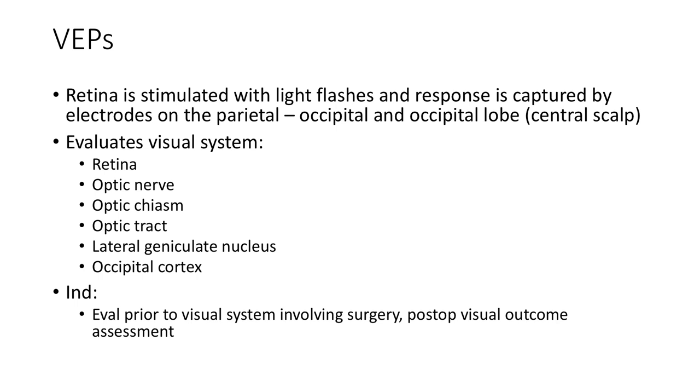We rarely see that used in the operating room because it's very affected by outside circumstances, neurological awareness, and obviously anesthetic drugs. But you do that as a prior assessment before you do surgeries on the visual system or to assess post-op visual abnormalities, vision loss.